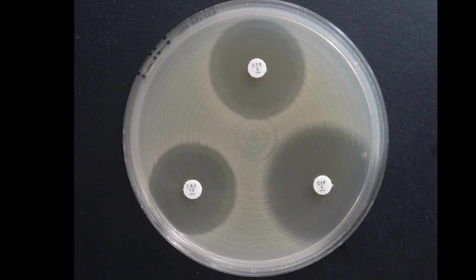And we would normally test clindamycin, erythromycin, and norfloxacin because those are a little bit more difficult to read, in different ways. So that's an example of where you can start to look more at standard reading instructions, fuzzy zone edges versus sharp zone edges. It's also possible to repeat the same exercise on 2 consecutive days, if you store the plates in the fridge in between. We have done that sometimes, and sometimes when people are out of work, for example, they can read on the 2nd day. But then we do 2 separate summaries, one for the 1st day, one for the 2nd day, because there might be small differences that will affect the zone sizes.